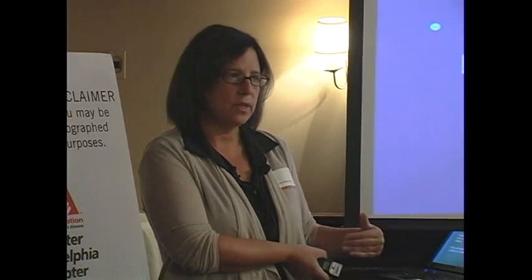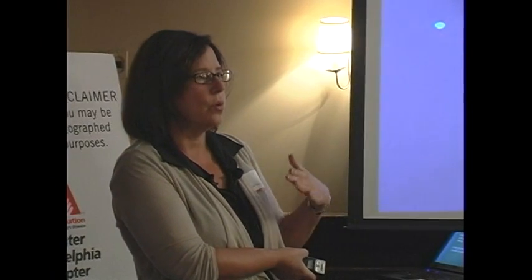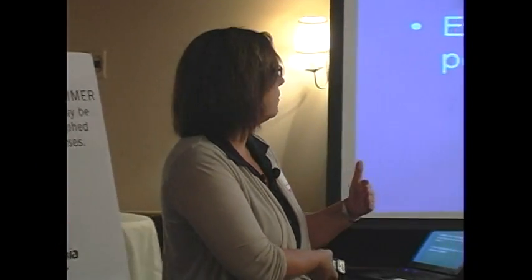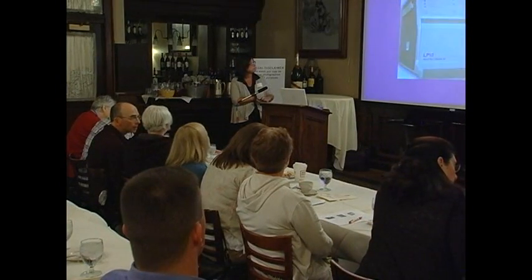So generally, when people are on a ventilator, they have a feeding tube in their stomach, because there's no way that a person on a ventilator could eat enough to adequately support themselves nutritionally. I'm not saying people can't communicate when they're on a ventilator, but speaking traditionally is generally not possible, and eating normally is generally not possible, but nutrition is provided in other ways.